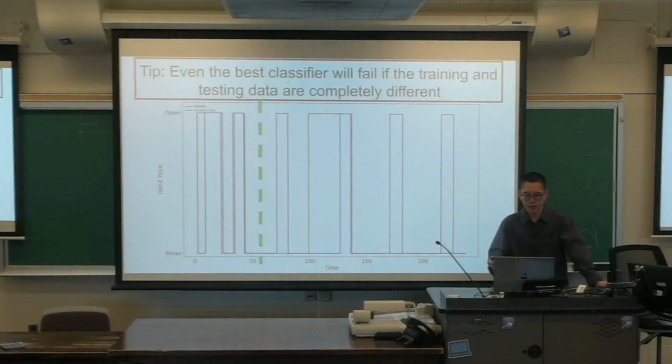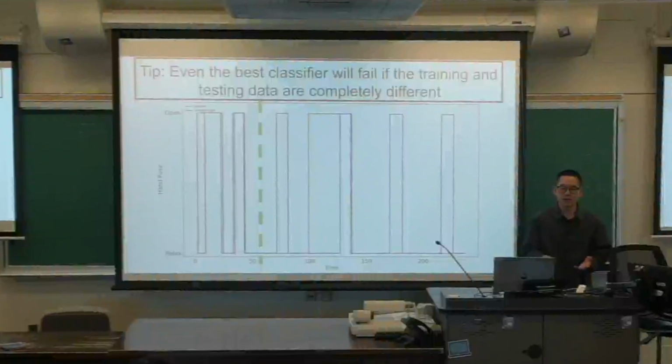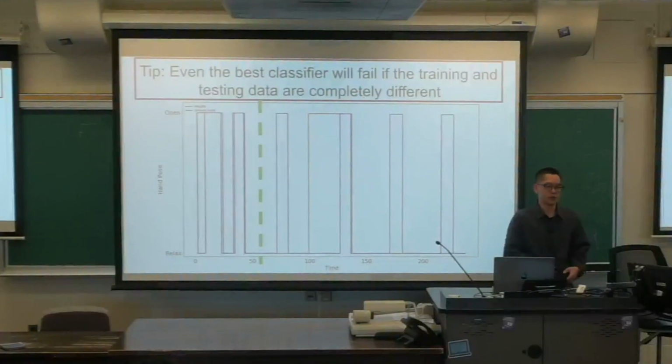The lesson we learn here is that when you train an algorithm and you have super high training accuracy, but it never works on the test data set, the things you can think about are, one, is it overfitting on the training set? Second, is there a big mismatch between your training data set distribution and your testing data set distribution? In this case, there is a big mismatch between train and test. You are expecting the algorithm to work on some conditions or distributions that have never been recorded in the training set.